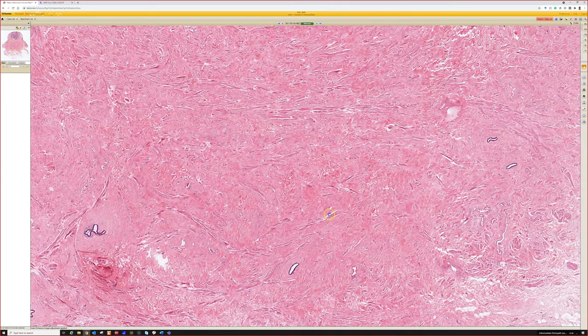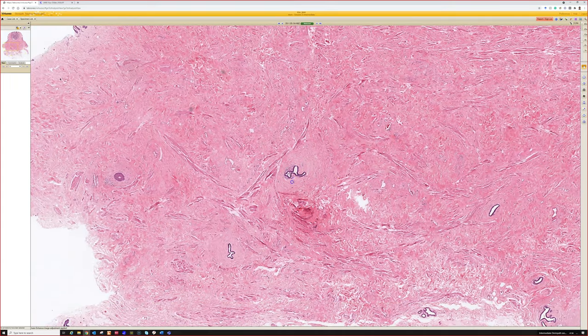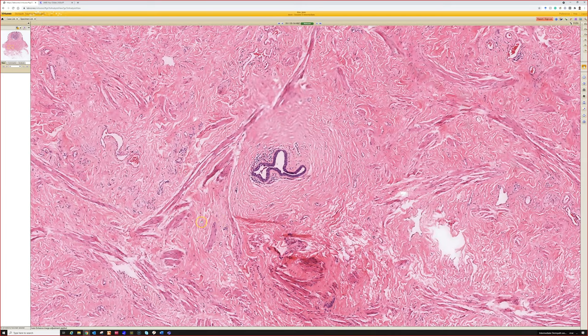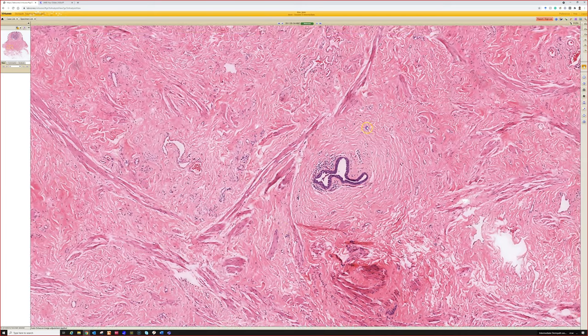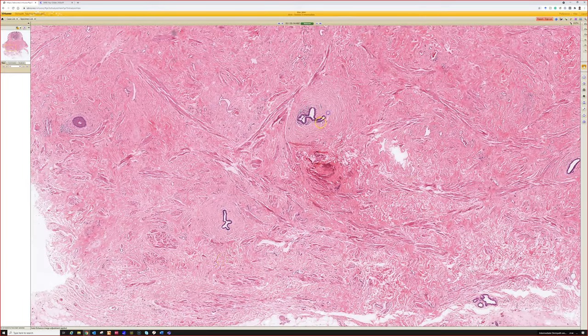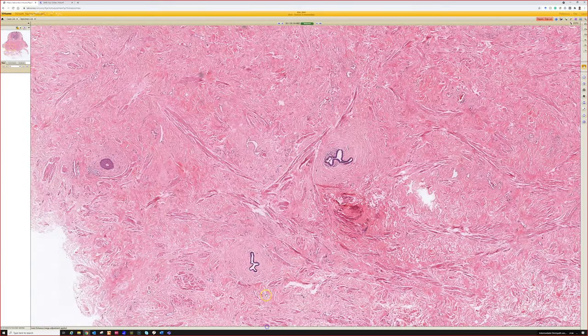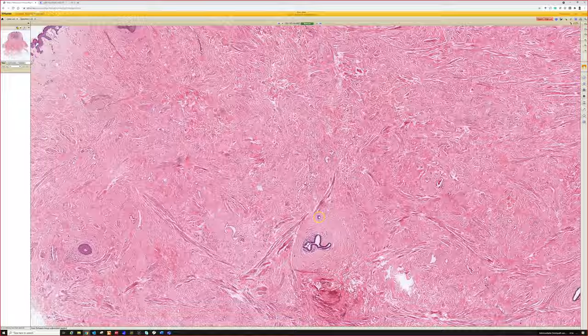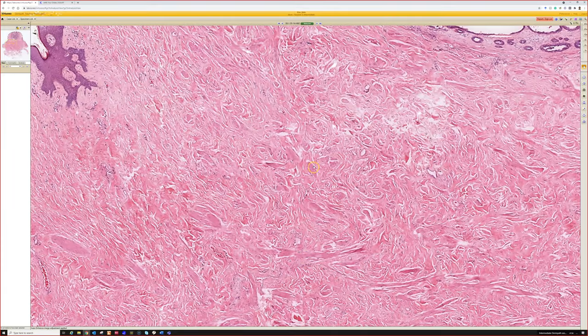So as we go further up here, look what we see. In the dermis, we see a thing that looks like a breast duct. These are lactiferous ductules or nipple ducts. And then there's lots of smooth muscle in the background. So a lot of times you're not going to see breast tissue. So you're going to have to recognize these structures and know, oh, that means we're on or near the nipple. Or maybe if we're not on the nipple, that it's an accessory nipple. And then there's lots of smooth muscle bundles.